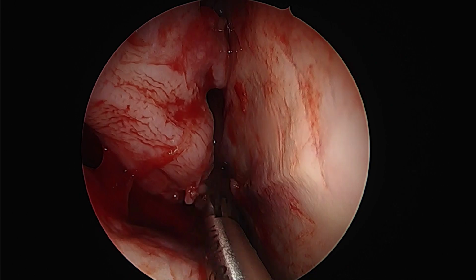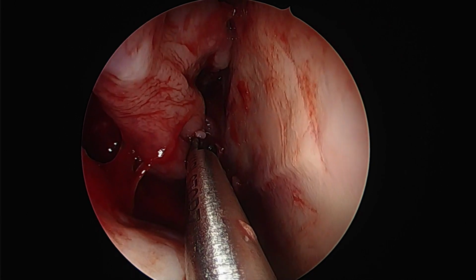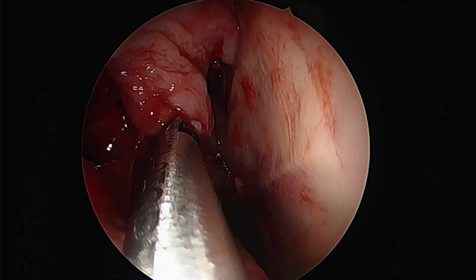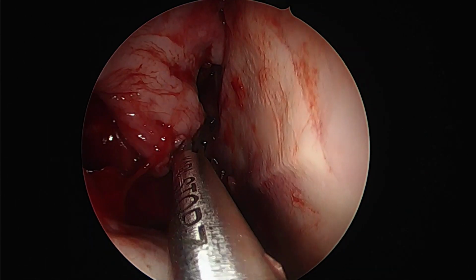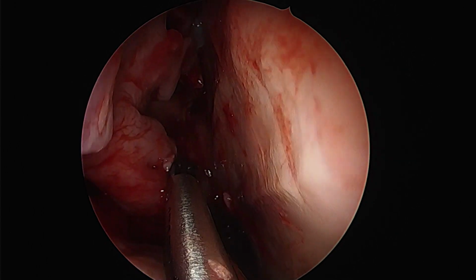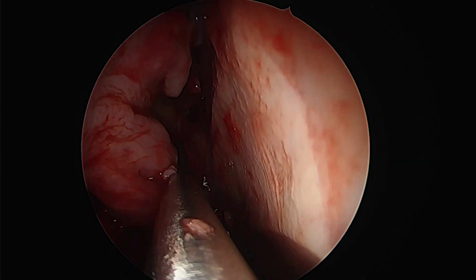The posterior most part of the middle turbinate is where it is attached, and it can be either cut using scissors, ablated, or here we use a simple straight through cut to crush the vascularity within it, the septal branch of the sphenopalatine artery.